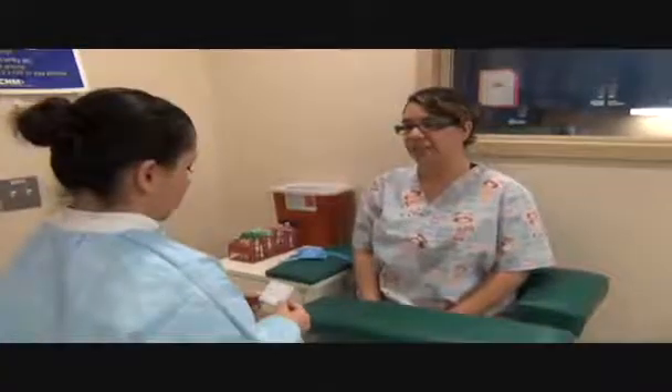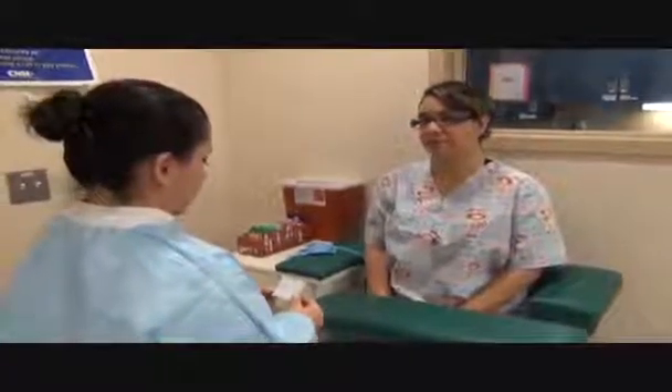Can you please state your name and date of birth? Laura Viegas, 4/22/75. Okay, I'm going to go wash my hands and glove up and I'll be right back.